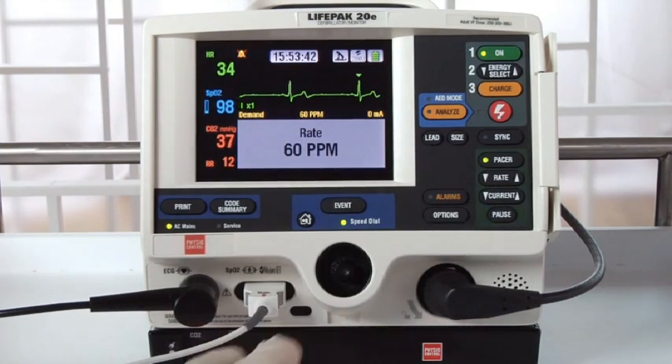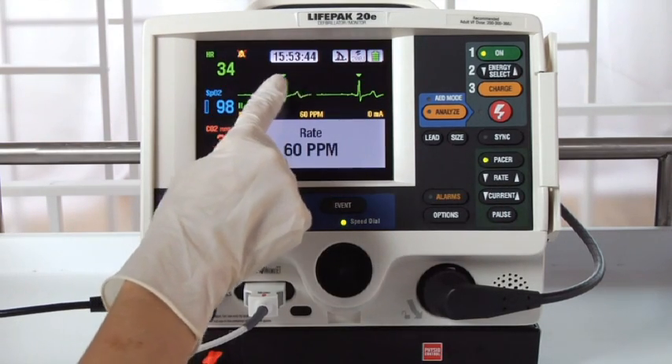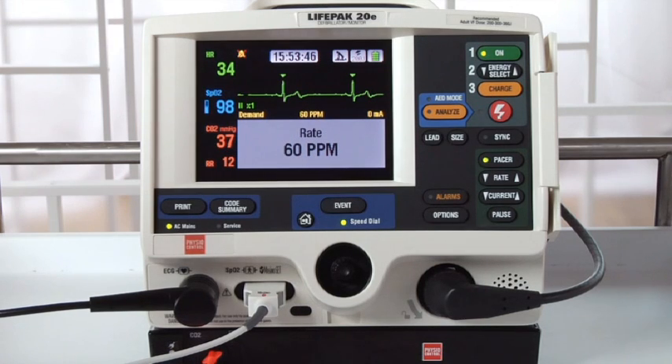Press PACER. You should see sense markers on each QRS, like these. If you don't see sense markers, or they're on the T-wave, select another lead until you do see sense markers.